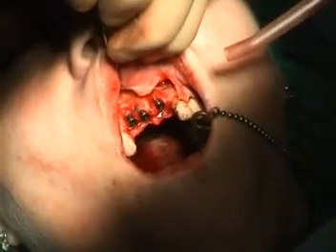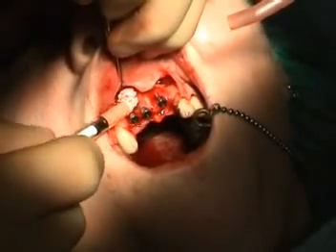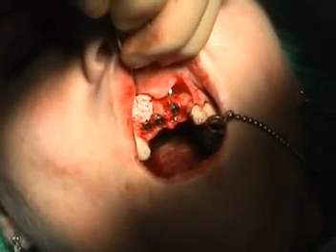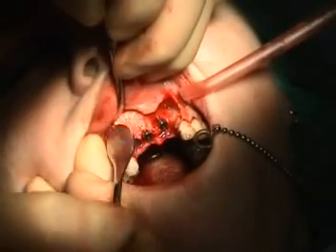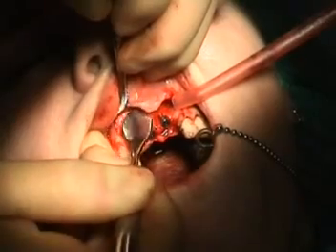The graft mixture, which was prepared earlier, is now used to augment the bone defect. The mixture is introduced using the delivery syringe. The mixture is moulded and condensed to ensure complete infill around the implants.